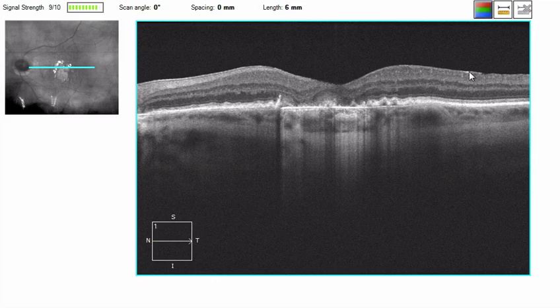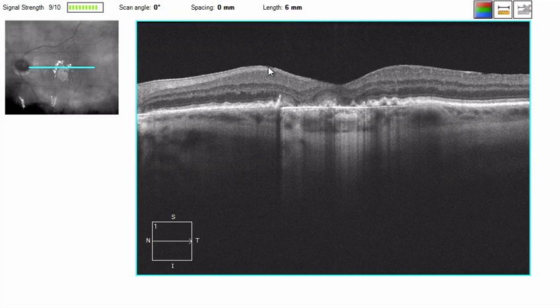As an aside, there also appears to be an epiretinal membrane present here nasally — it has a very distinct bright line. This may just be the posterior hyaloid, as there is certainly no wrinkling of the inner retina visible.